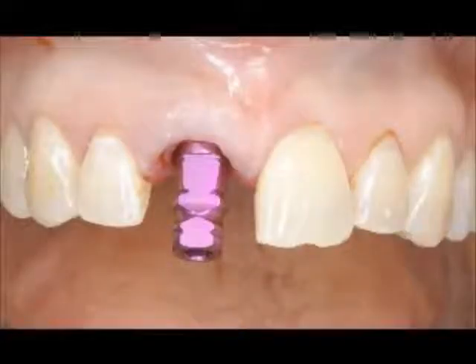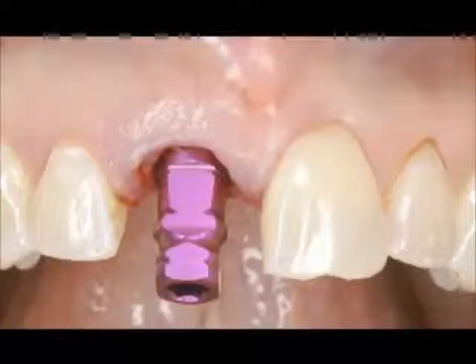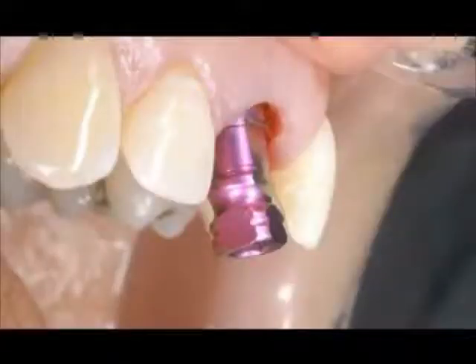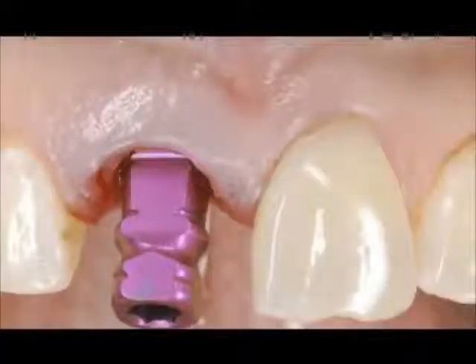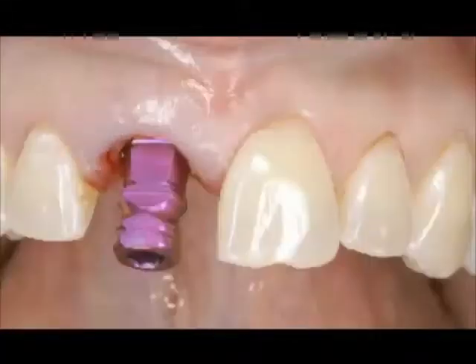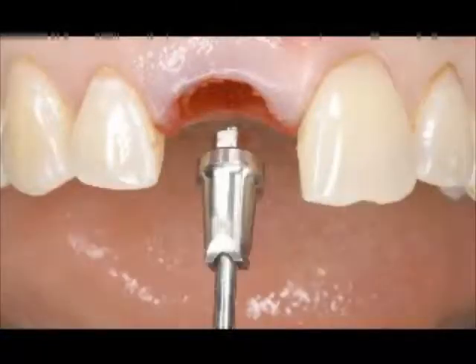Day of surgery, it looks like we've barely insulted the surrounding tissues at all. And we want to make sure that we place the implant below the gingival margin by at least 2 to 3 millimeters. And again, you can appreciate the accuracy of the guide in placing this implant, and we know now the head of the fixture is at appropriate depth. The next phase is what to do with this implant.